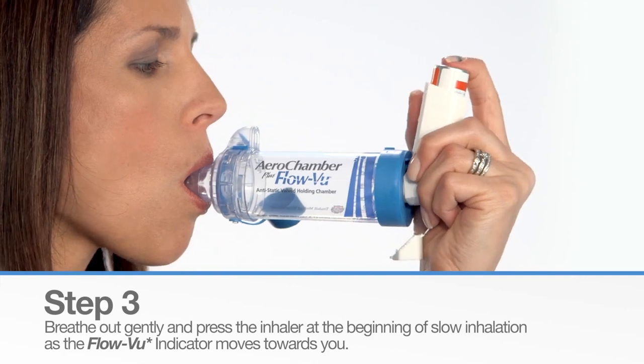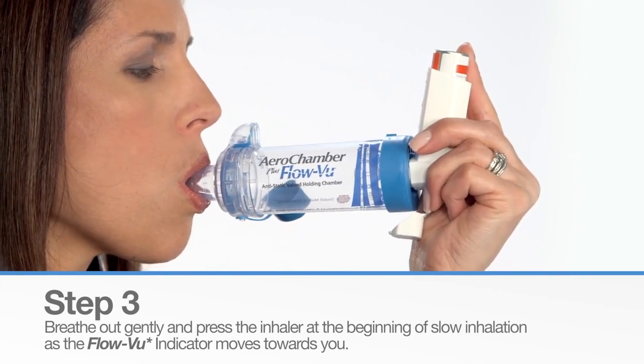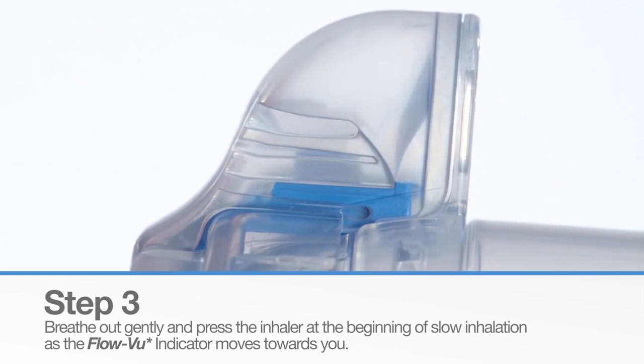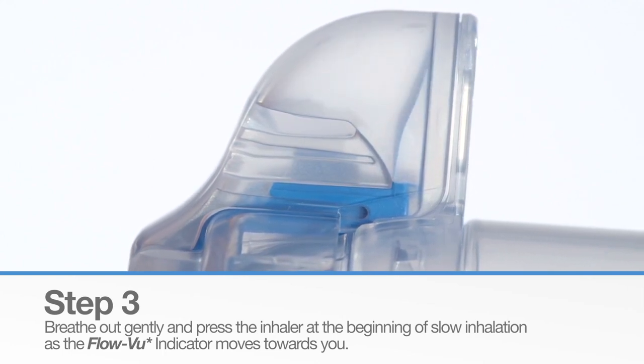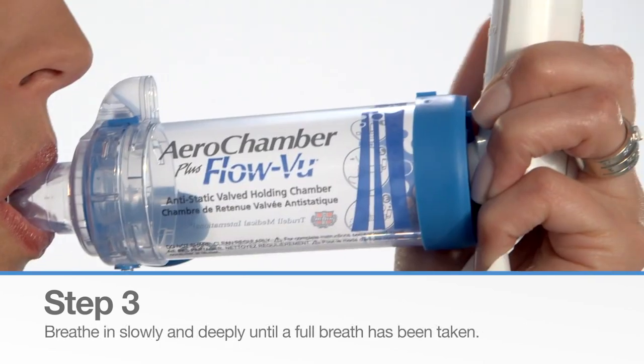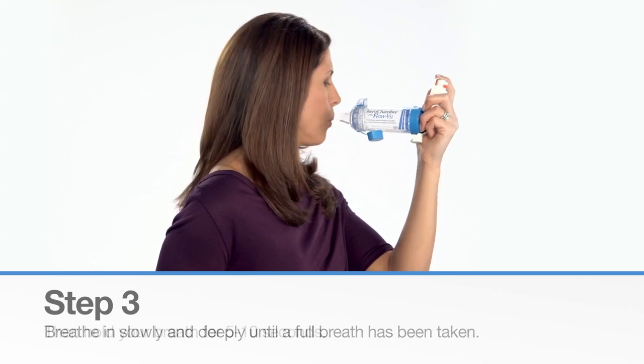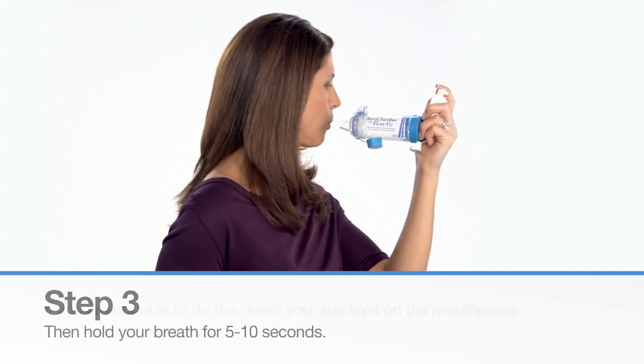Breathe out gently through the chamber and then press the inhaler at the beginning of a slow inhalation as the FlowView Inspiratory Indicator moves towards you. The best way to breathe in your medicine is to take one long, slow, deep breath followed by 5-10 seconds when you hold your breath.